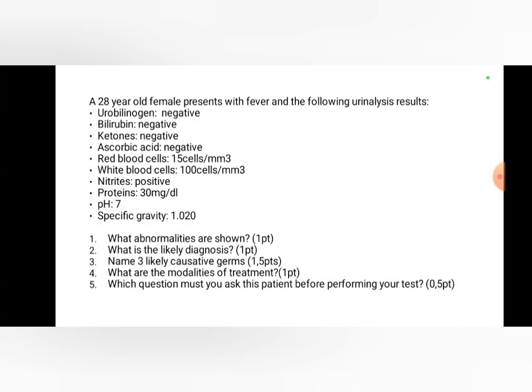Now the question is, with just the urine dipstick, are you capable of knowing if the jaundice is a result of a high level of conjugated bilirubin or a high level of unconjugated bilirubin? The answer is yes. It is based on the urobilinogen and the bilirubin. Is it clear? When the bilirubin is high in urine, it means that there is more conjugated hyperbilirubinemia. Is it clear? Now the question is why.